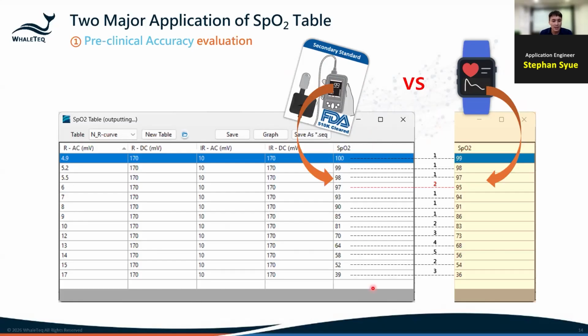For example, we create this table based on the secondary standards, and then I bring the DUTs here, put them on, and let them get the signal sent. Does it show just like the readings in this column? If it's not, please note the tolerance and in which region. For example, from 90 to 100, we usually try to maintain 1% accuracy. From 90 to 82%, down to 70, it can be 3 to 6%.